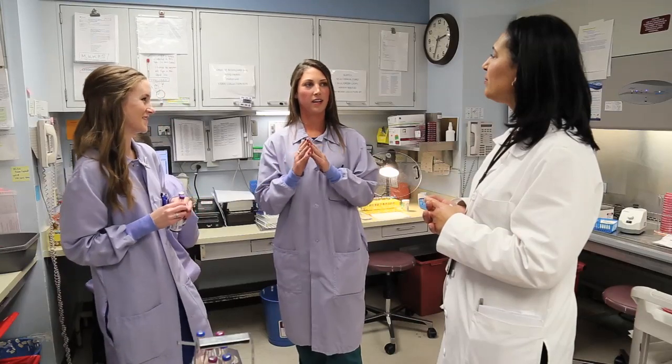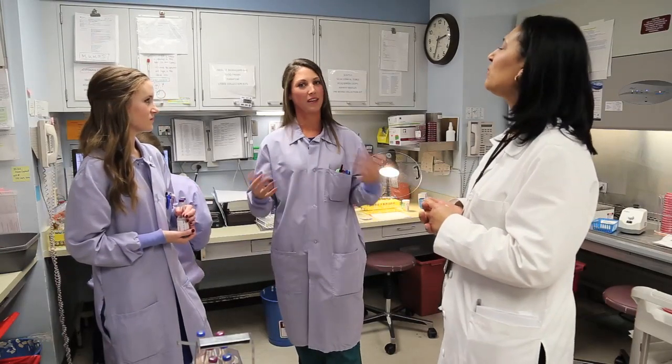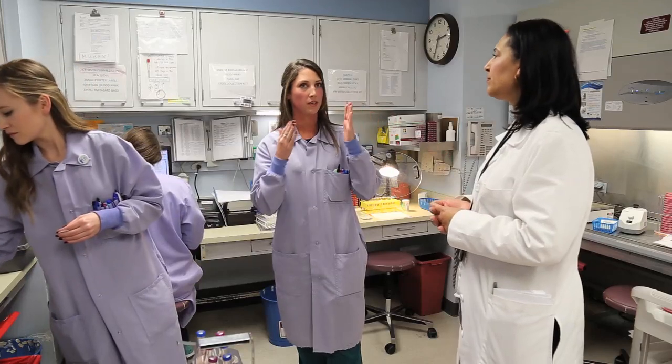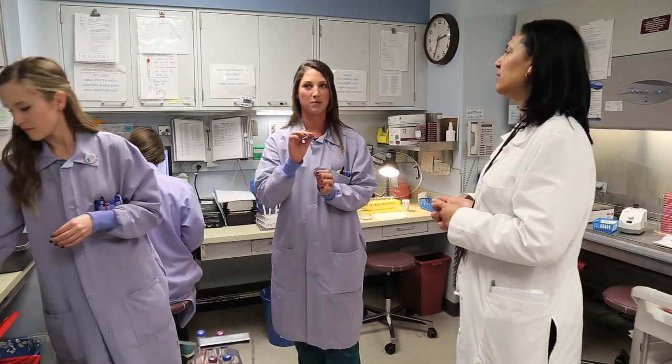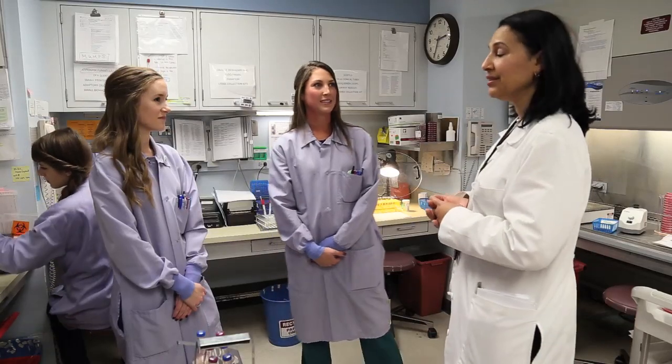Okay. Sometimes, and this does happen a lot with our aerobic, anaerobic cultures, they'll be ordered very, very vaguely, just wounds. But we need to know specifically where that's coming from. We have lots of normal flora all over our body. It helps us to determine what we work up on the benches if we know exactly where it's collected from. Or sometimes it'll say other, and we have no idea what that means. So we have to go tracking down who collected it, what they actually collected. And it's just much easier right from the get-go if it said what we needed. Okay. Wow. That could be a problem.